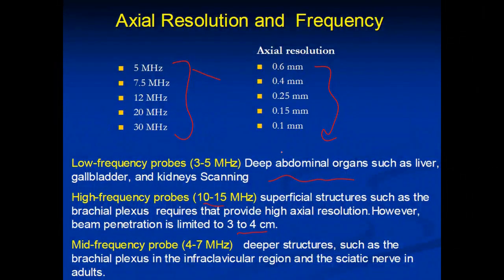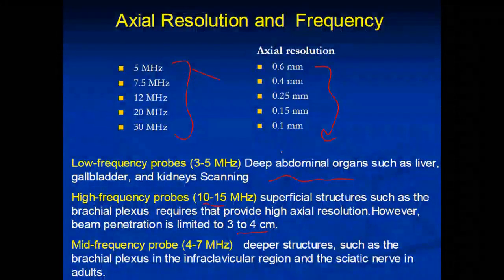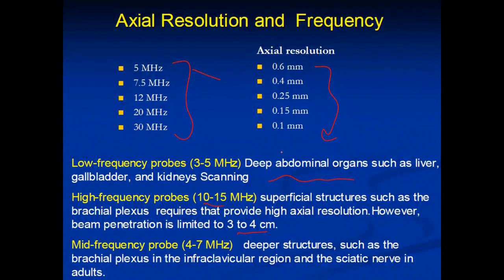The multifocal approach helps you with resolution and adjustment. Instead of having just one focal zone, you now have different focal zones.